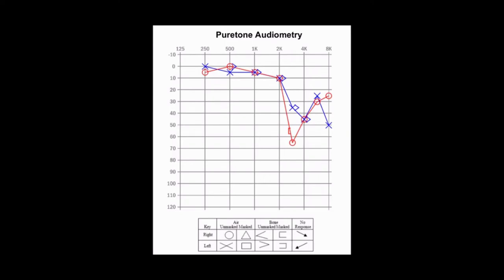When you're getting your hearing tested and asked to respond to a sound you just barely hear, this is where we make a mark any time we receive your response. When you barely hear the tone in your right ear, you can see the red circles on the red line — that's your right ear. The left ear is the blue line or blue X's. Anything at that 25-decibel line and above is considered normal hearing. When we get out past 2,000 hertz on this audiogram, we see responses at 35 decibels in the left ear, all the way down to 45, and in the right ear — the red line — all the way down to 65. This indicates that this patient has what we would call a high-frequency sensorineural hearing loss.